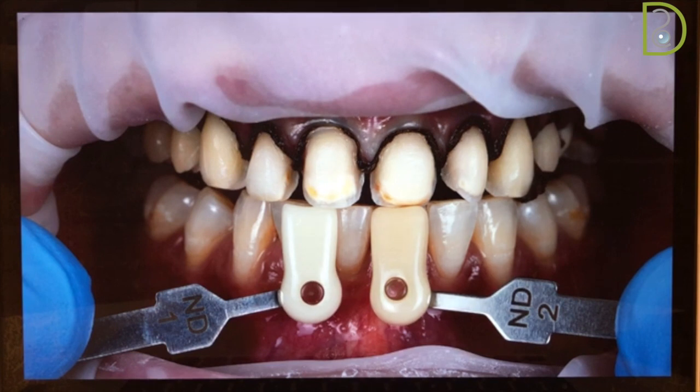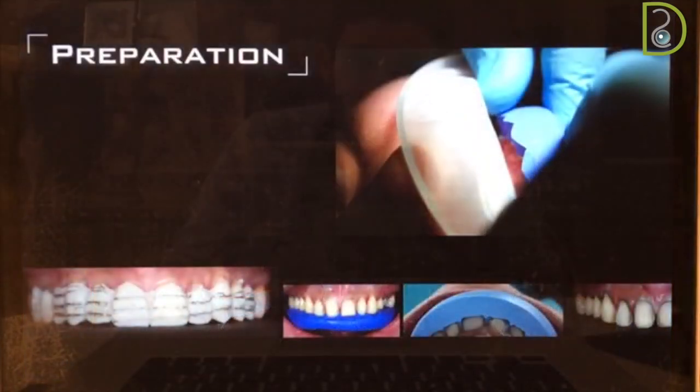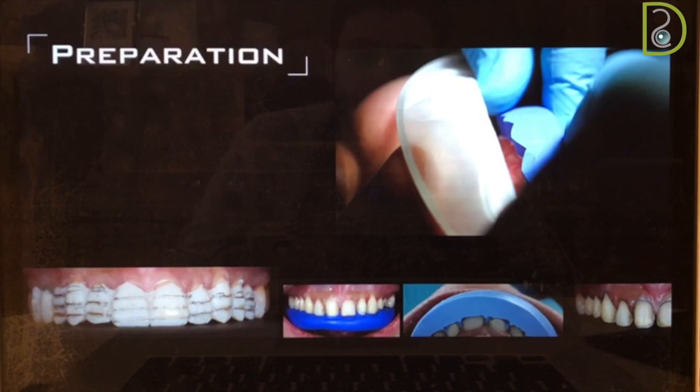So as you all know, as examples, you have the medium opacity, high opacity, low translucency, and so on. So this is going to be helpful for you and promising the patient with the aesthetic results she's looking for. Now, to summarize what we just mentioned, here's a short clip explaining the mock-up, the guided preparation, checking, and final impression making.